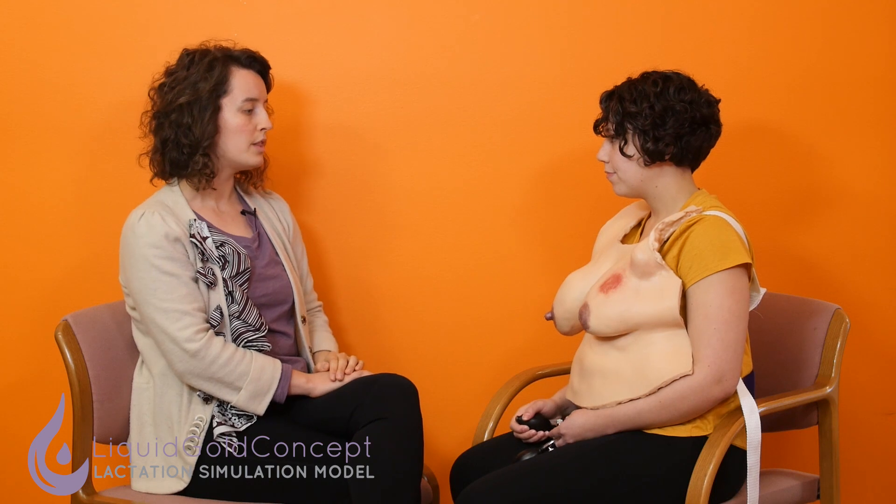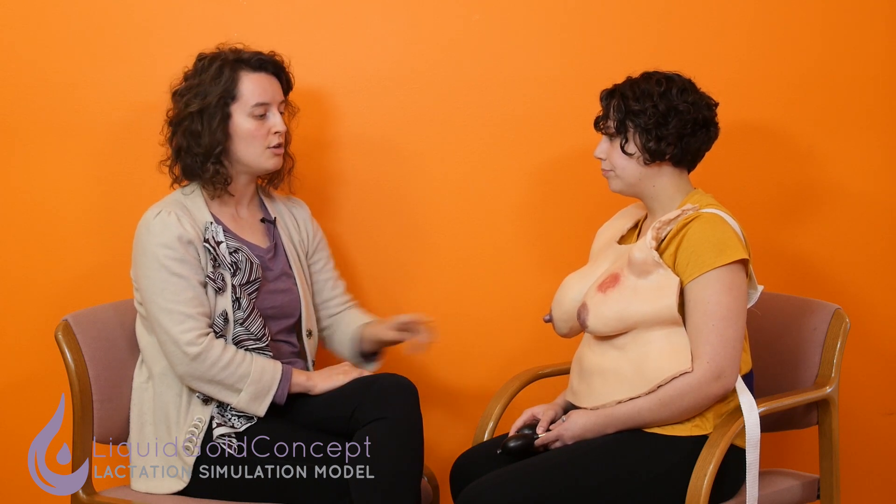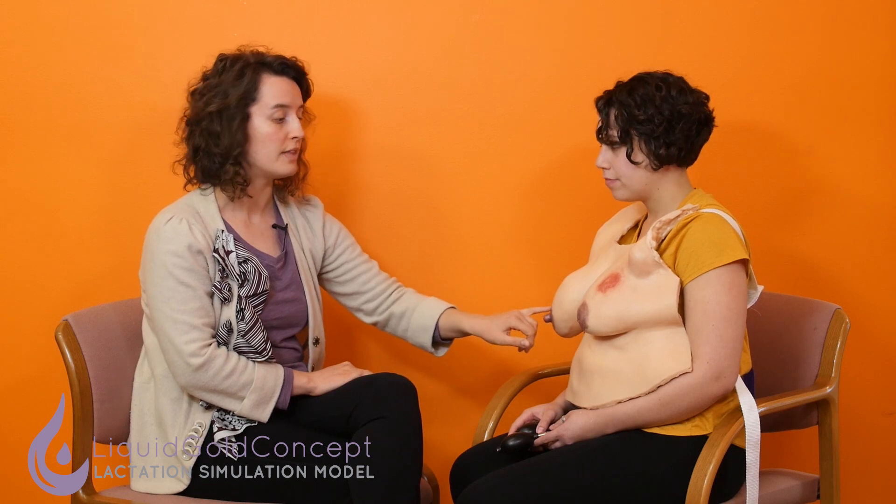With the Advanced LSM, just like with the Essential, you can also practice hand expression and breast pump attachment. What's really exciting is that if you have both models — the Essential and the Advanced — you can actually practice flange sizing for four different kinds of nipples and develop really unique case scenarios with both LSMs. These could work for nursing students, medical students, practicing physicians, lactation consultants, and of course mothers and fathers. Thank you so much.